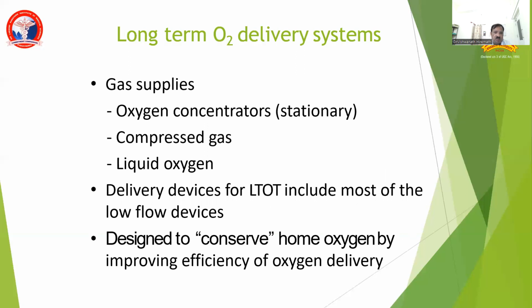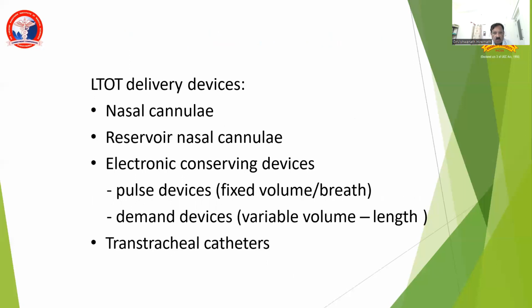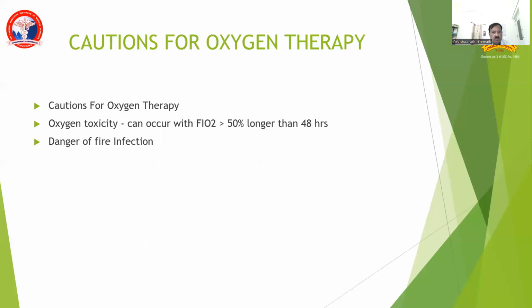For COPD patients, long term oxygen therapy is required. We can use an oxygen concentrator. Long term oxygen therapy devices include nasal cannula, reservoir nasal cannula, and transtracheal catheters, most of them low flow devices.